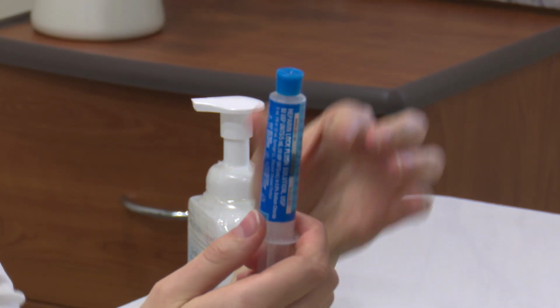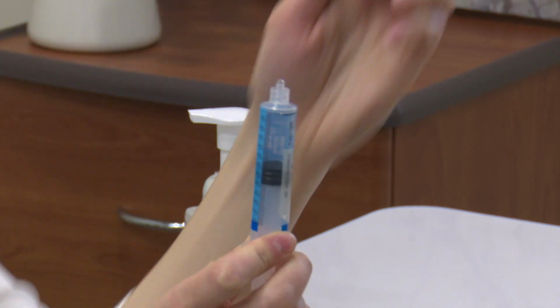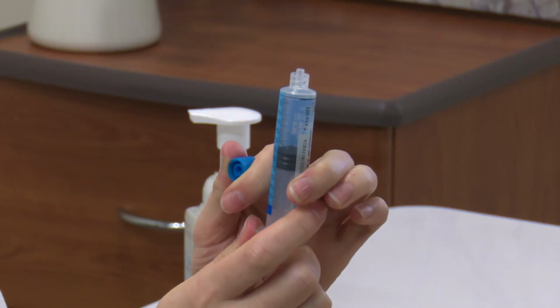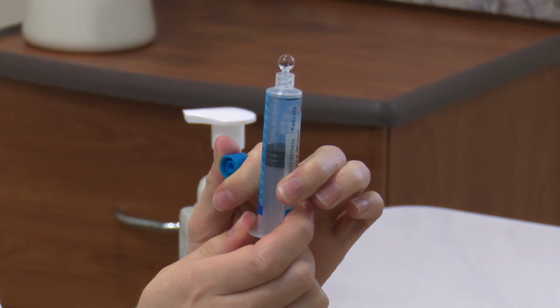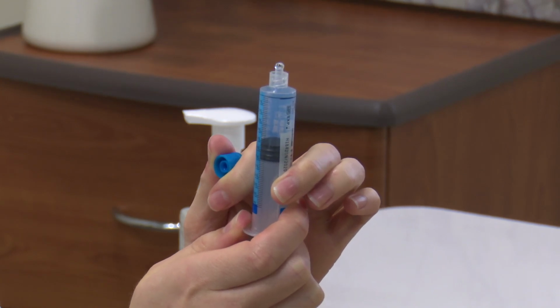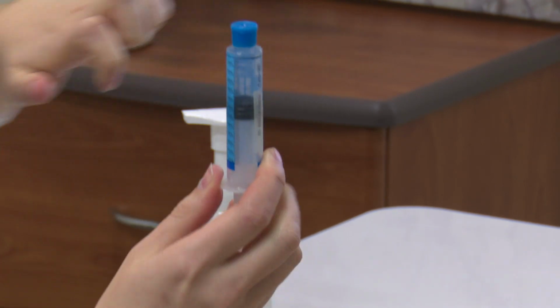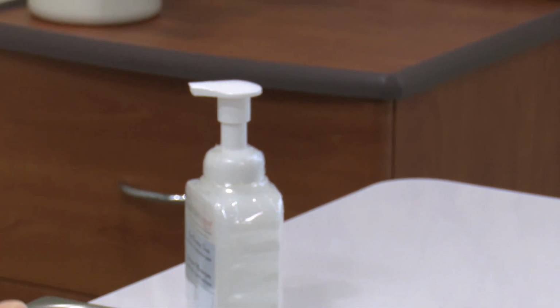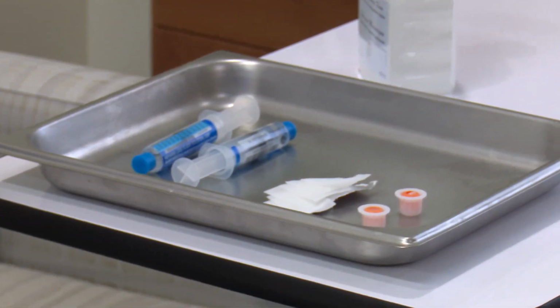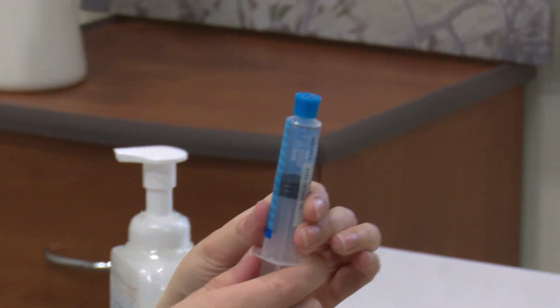Remove the cap of the heparin syringe and slowly push the plunger up to remove the air bubbles. Put the cap back on the syringe and place it back onto the work surface. If your child's central line has 2 lumens, repeat these steps with the other lumen.